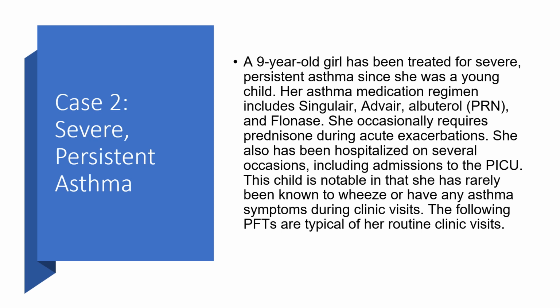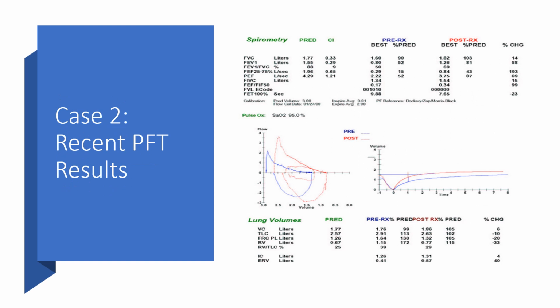Not a good finding. This patient is notable in that she's rarely been known to wheeze or have any asthmatic symptoms during clinical visits. The following PFTs are typical of her routine clinical visits. Let's take a look. So again, not trying to dazzle you folks. There's a lot of information on this slide, but like we did with the other case, let's keep it mainly concentrated on the upper right, where we have our spirometry, and the lower left, which are our lung volumes.